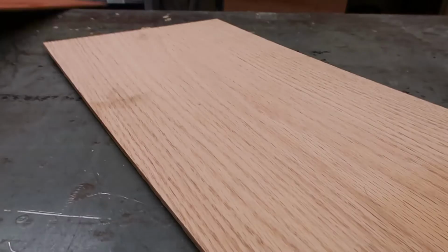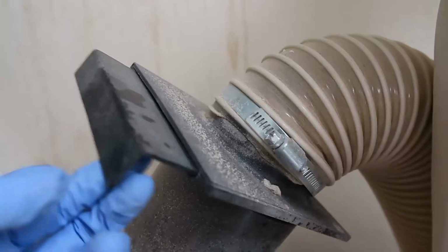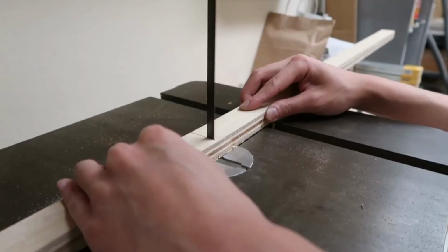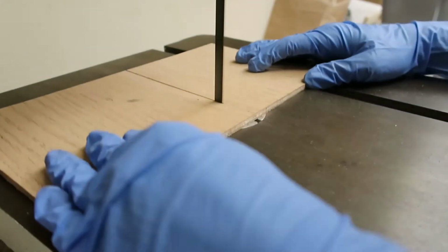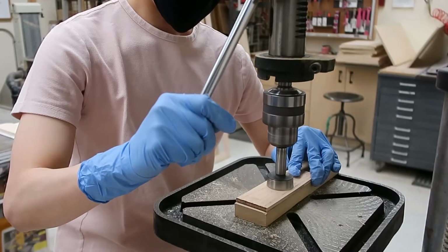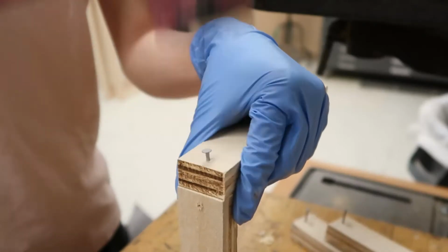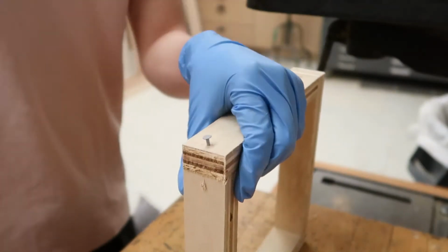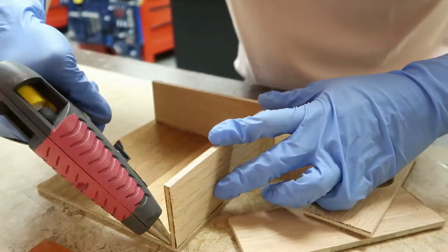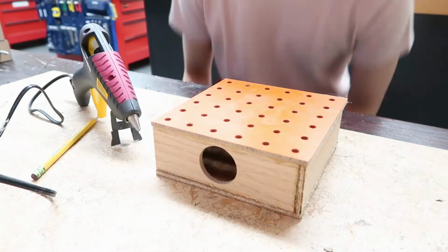First is to build the vacuum former. To build it, I need some plywood and a pegboard to make a wooden box and a wooden frame to hold the plastic. So I cut the plywood and the pegboard to size and drill a hole in one of the plywood for the vacuum. Then I assembled the frame and I sealed the gaps on the box with hot glue to make sure that air can only go through the holes on the pegboard.